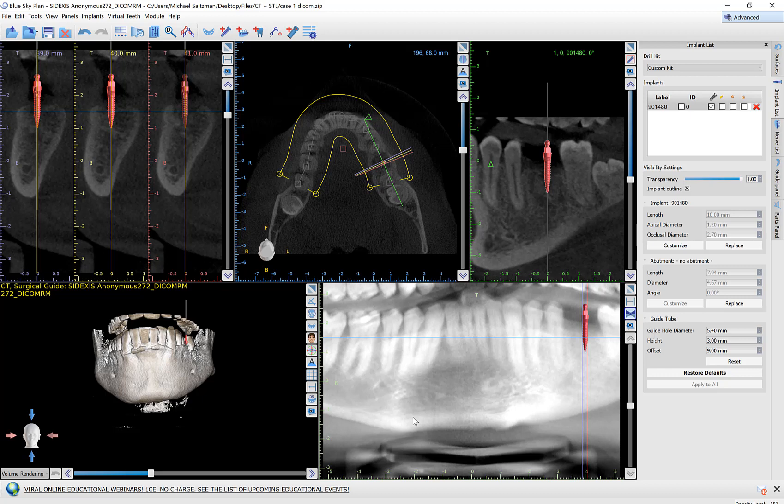Now why is this useful? One reason is for exactly this situation where we don't have the correct guided surgical kit information associated with an implant. So if you have the information and you enter it once, the software will remember it for you. Another useful application could be if you are using an implant system that's not yet in the software — even though you should tell the company to get in touch with us and we'll integrate their system at no cost; they just have to provide the relevant data.